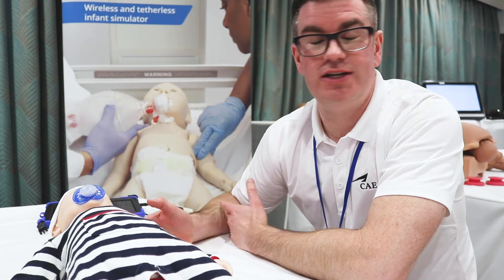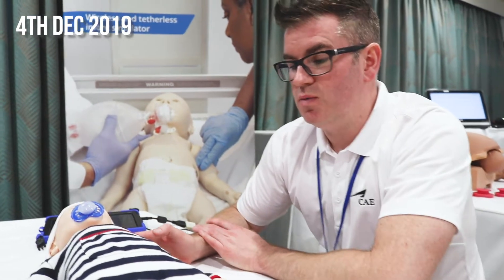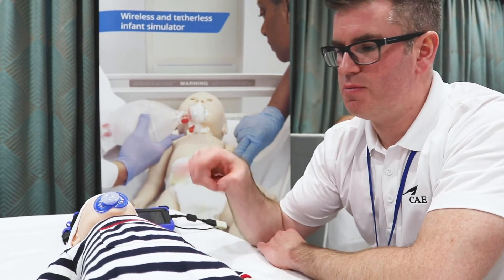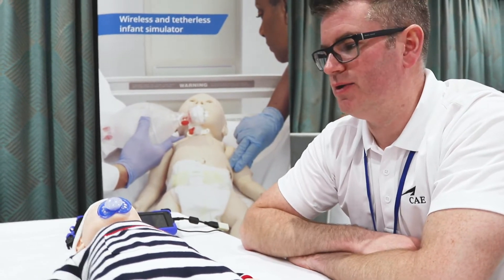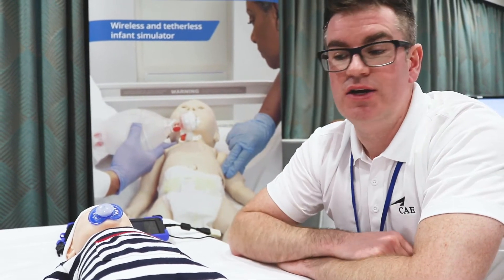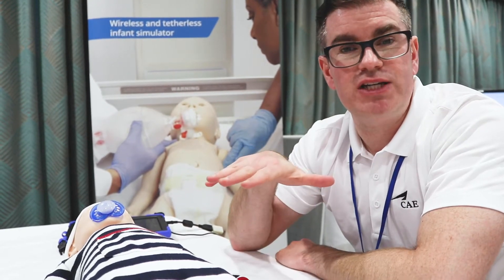CAE Luna has literally launched today in the UK. She is a 1 to 28 day baby, completely wireless, and she is going to come in three forms: a base model, a lower cost model, a middle range model, and an advanced model.